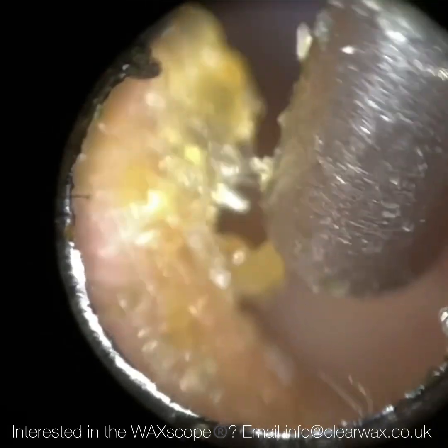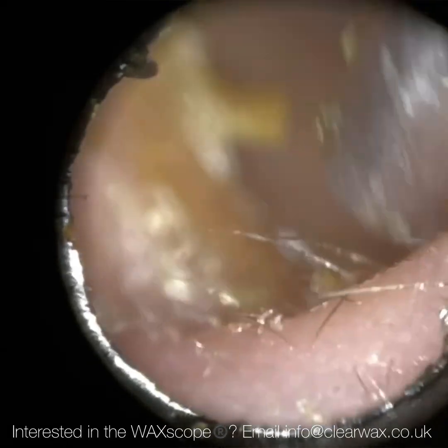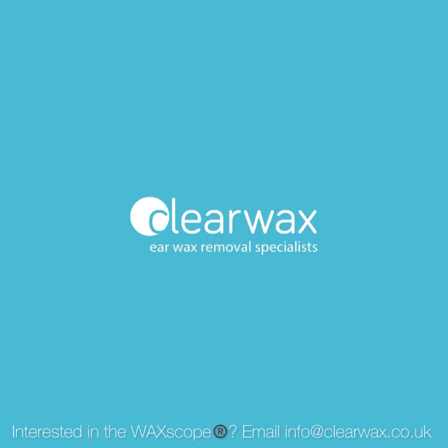So just mopping up, and you can just see the magnification. It really does zoom in. You can see all the fine detail.